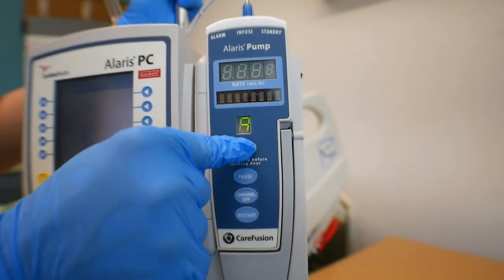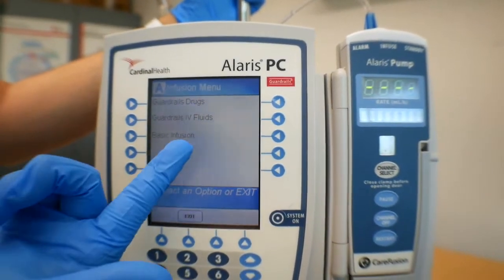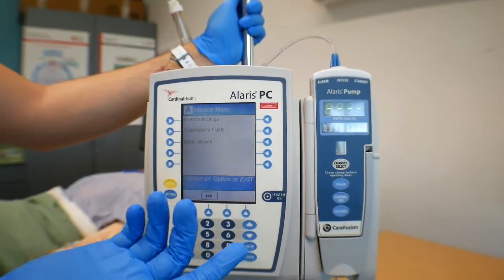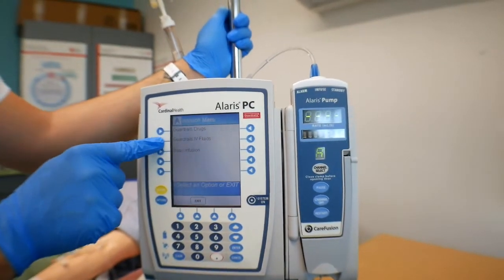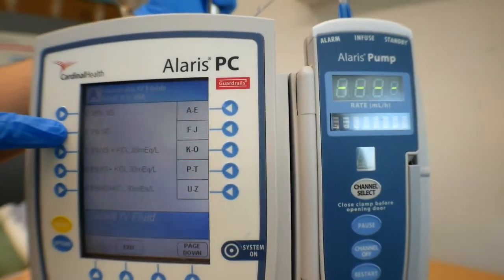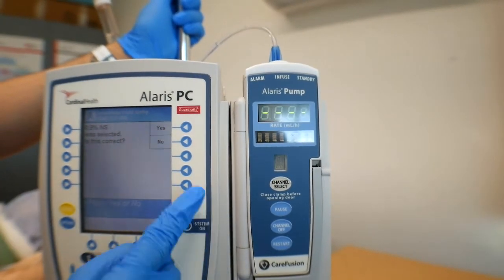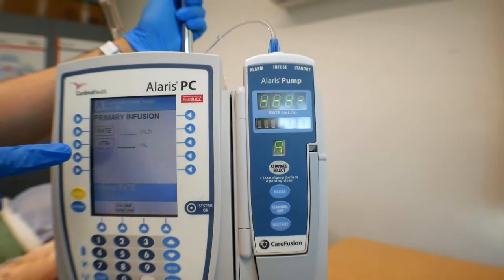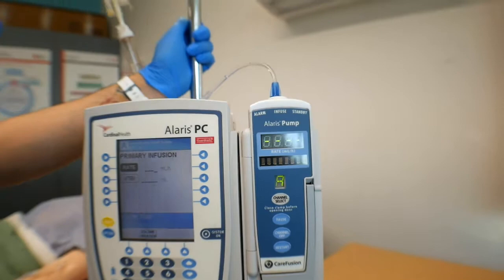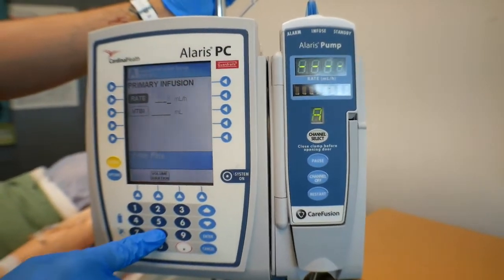For you to select the channel, you don't press here, you actually press on the channel itself. So press channel select, and you're going to have the options if you're infusing drugs, IV fluids, or just basic infusions. So remember, we're ordered to infuse IV fluids of normal saline. So you're gonna press this. Normal saline was selected. Is this correct? So you're gonna press yes. Okay. So now remember the rate ordered. So for this, it's 83 mils per hour. So you just go ahead and put 83.